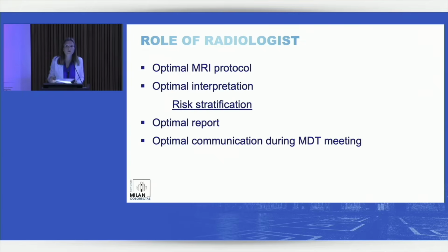So the role of us as radiologists is, not only to provide an optimal MRI protocol, but also give an optimal interpretation of the images, and with that provide a risk stratification. We need to summarize that in an optimal report, and of course also do optimal communication during the MDT meeting.